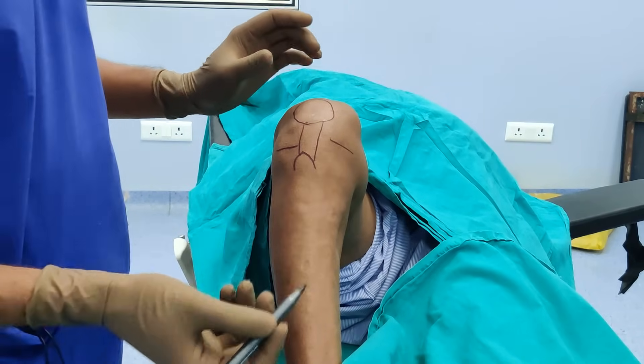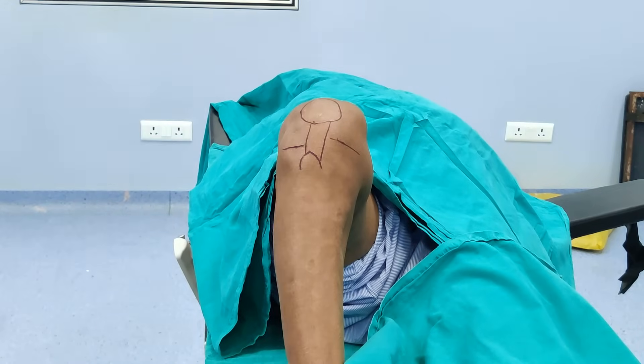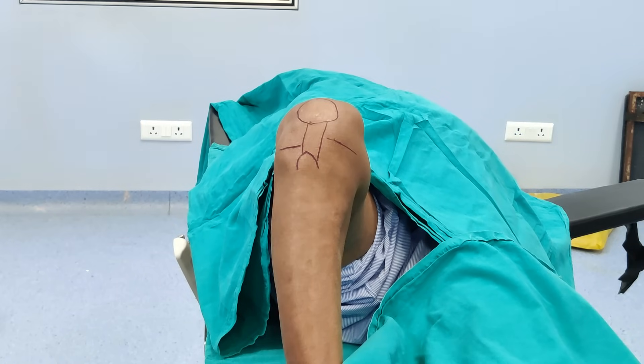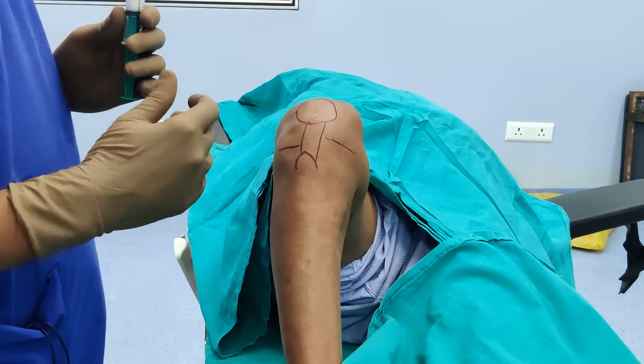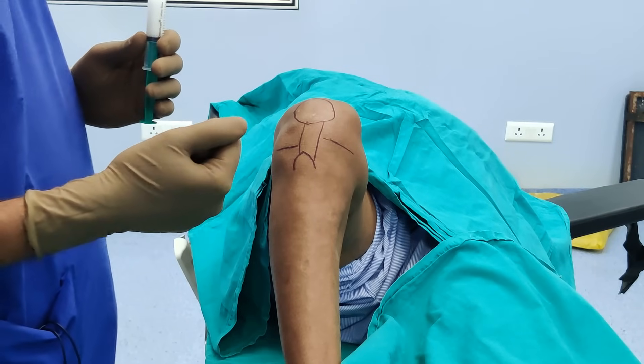The other commonly used approach is the lateral approach. You can use that as well, but I find it extremely painful, especially in somebody who has got arthritis. Sometimes it is very difficult to find the place and your needle hits the patella; sometimes it hits the femoral condyle and it can be quite a painful procedure.